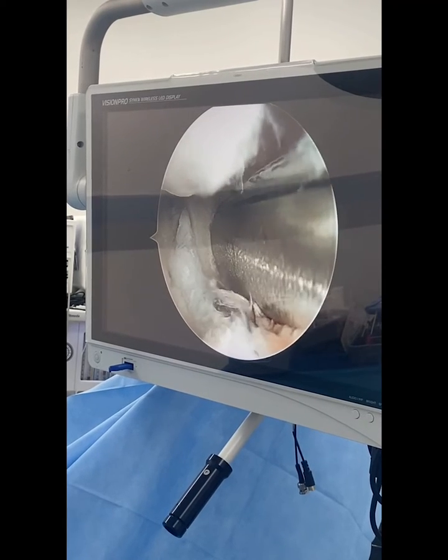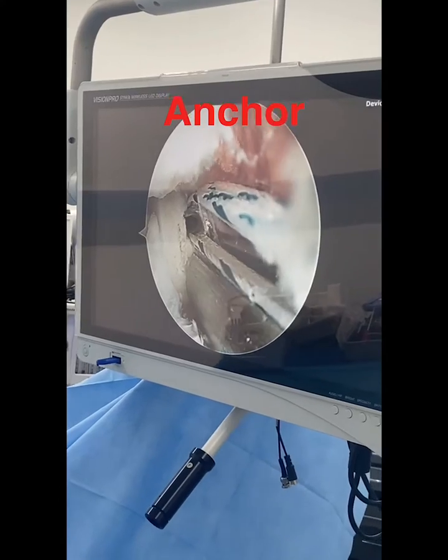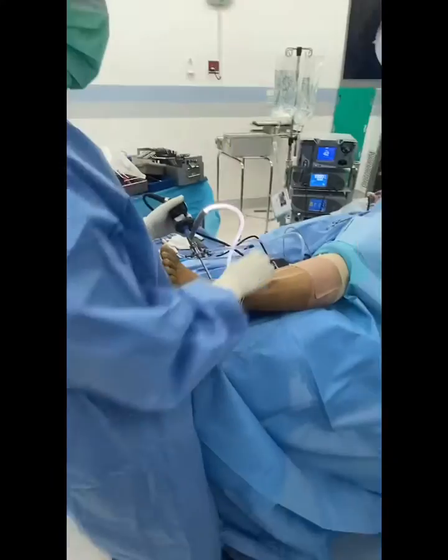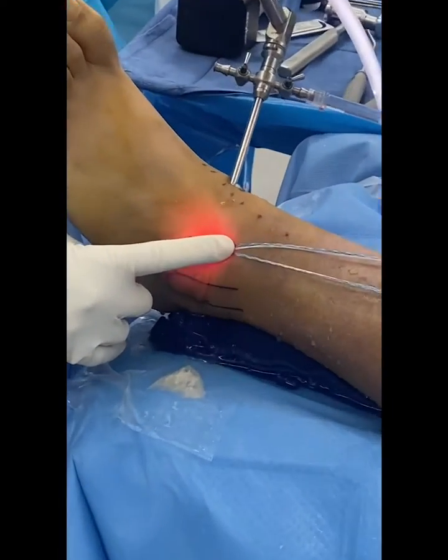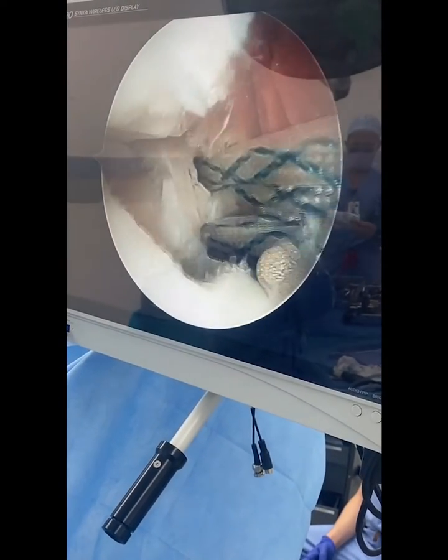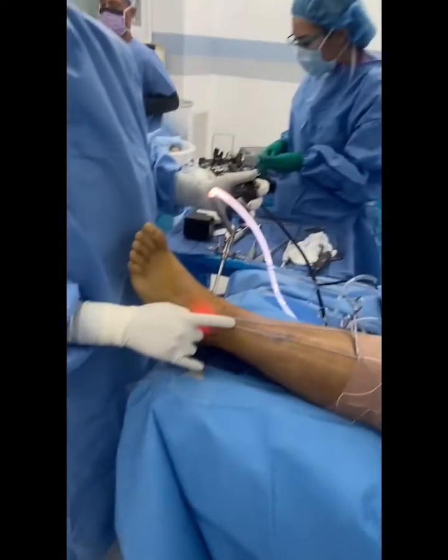Here I'm seating down the anchor with a mallet, and here's the anchor flush on the bone. This will be done one more time, just inferior or distal to that initial footprint. Here are the suture anchors in the fibula, and here are the two anchor sutures at the arthroscopic incision. You can see those are nicely embedded within the bone and they implicate pretty well.